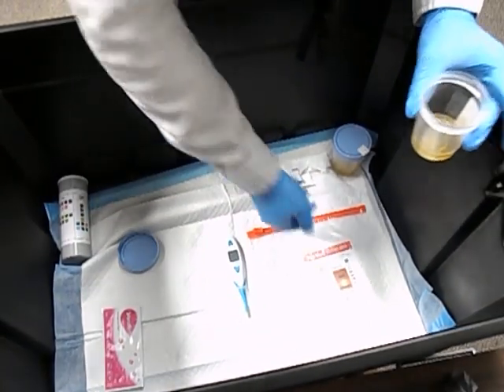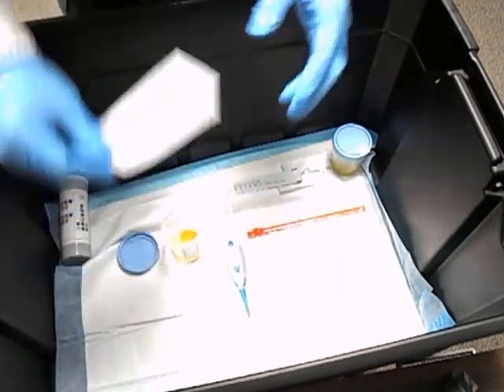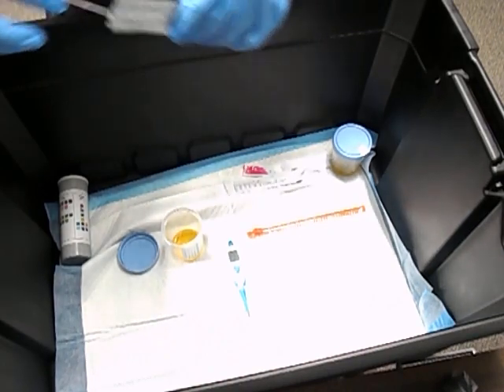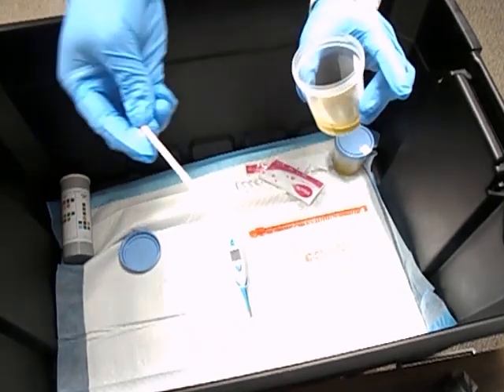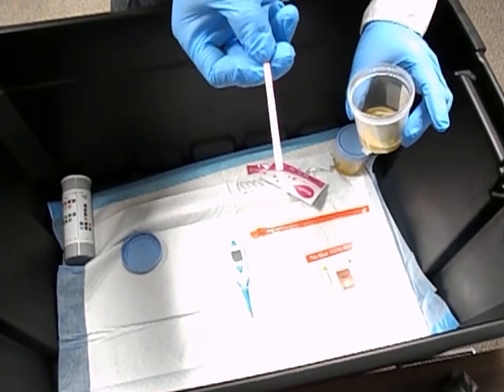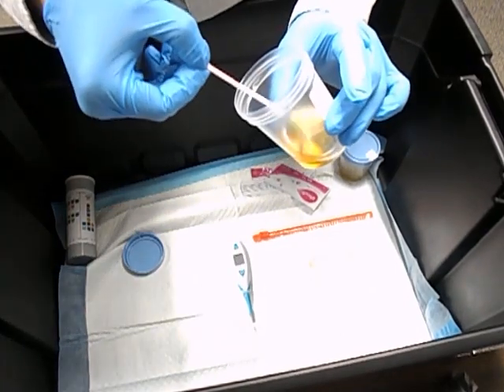Next I'll do the pregnancy test. Same concept — on the pregnancy test strip there's a line at the bottom that you don't want to pass. Dip it in for five seconds.